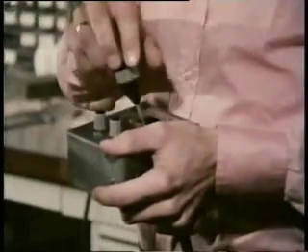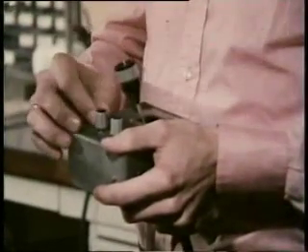Now let's try the areas flanking the on zone. Here it produces a burst of impulses when the light goes off. We plot the off zone with minus signs.